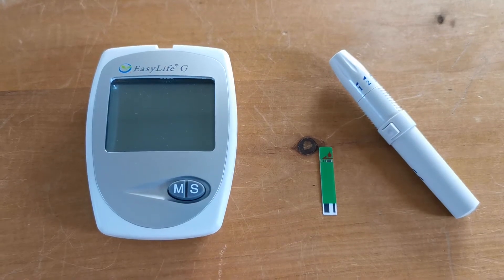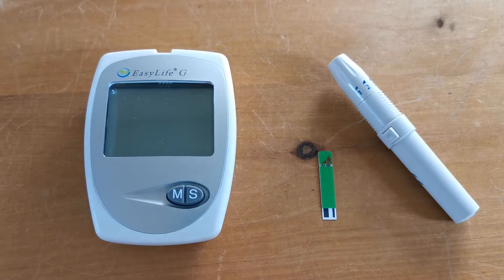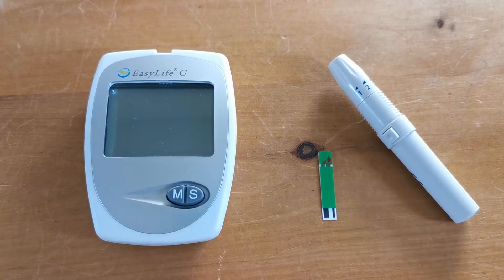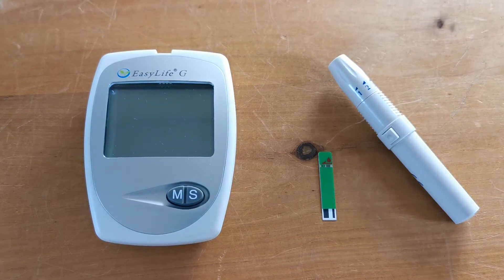Welcome to this product demonstration video where we're going to show users of the EasyLife meter system the correct procedure and where to apply your blood sample to your test strip. We're going to demonstrate that on an EasyLife glucose meter, but this technique and the entry aspect on the test strips is identical for cholesterol tests, haemoglobin tests, or uric acid tests.